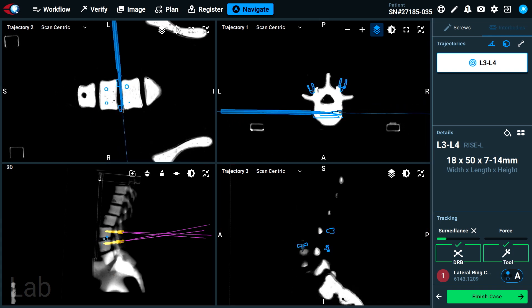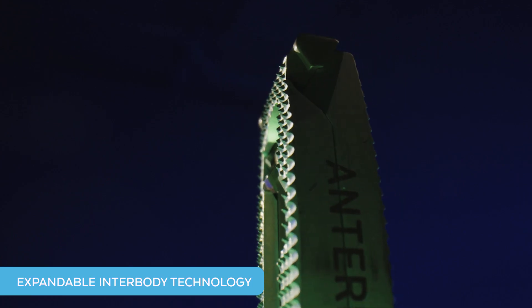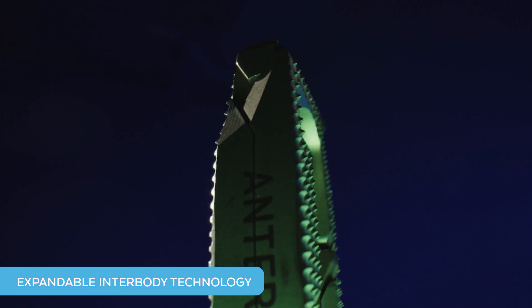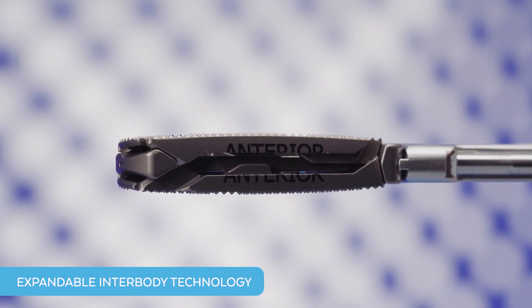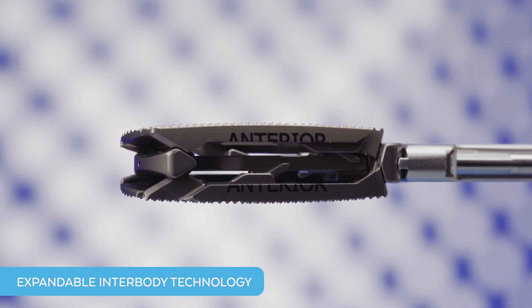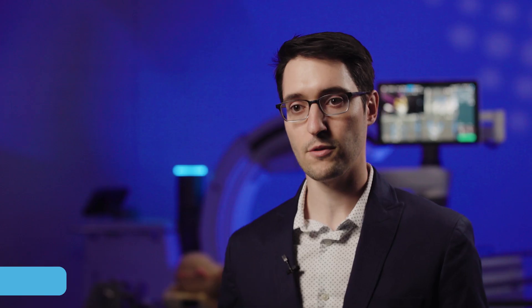The next key component of Excelsius Prone Lateral is expandable technology. When using expandable technology, the implant is inserted at a reduced height to help maintain integrity of the end plates and reduce impaction forces. In combination with the backstop bolster on the patient positioning system, the Excelsius Prone Lateral Surgical Solution provides excellent capability to minimize patient movement.